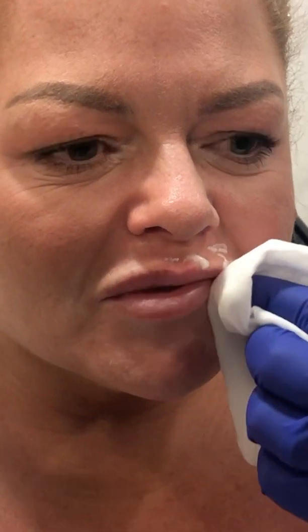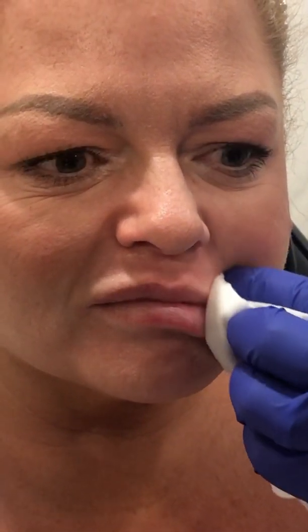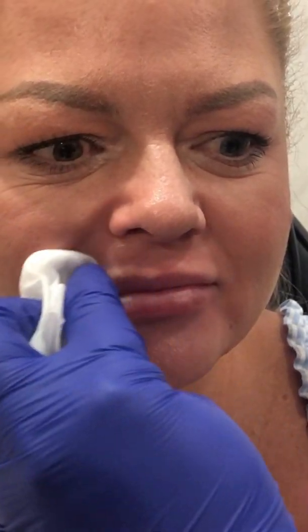What I'm going to do now is just take off this numbing cream. This has been on for around 10 to 15 minutes — we just used LMX4, just to numb the lips a little bit. You can see looking at the lips they look fractionally white, which is quite normal.